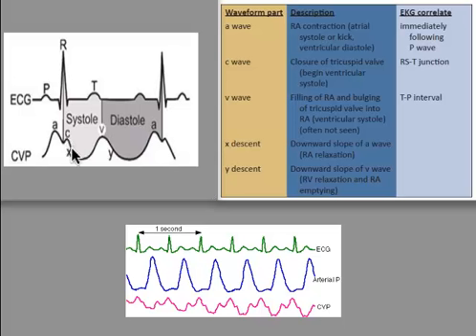The ventricles push out all of their blood, pressures drop, and they drop again until essentially a pulse of blood goes all the way through the body, the arteries and back through the venous system, and then the second rise is actually the filling of the right atria. As those atria fill, the tricuspid is closed, remember, so you're going to start to get an increase in pressure to the V wave.